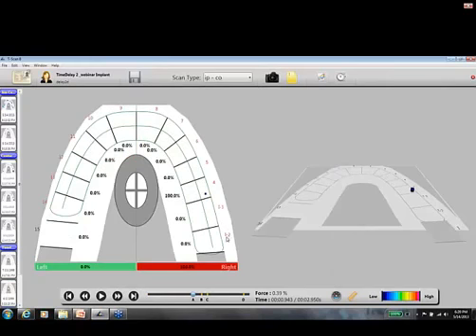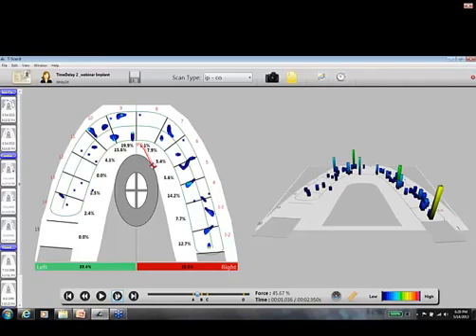Okay, so our implants are labeled here I-2 and I3. So we have an implant on 2 and an implant on 3. And so this is the patient closing and opening. And what we see is this early force on number 2. So that's what you don't want on an implant, is that shear force on an implant.